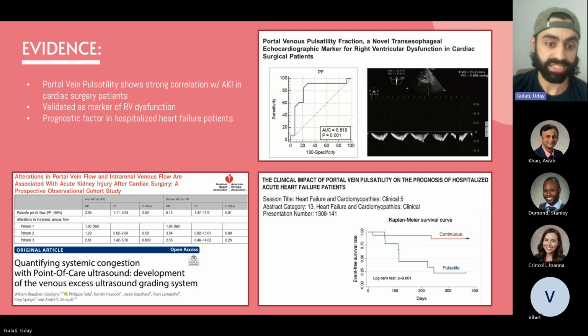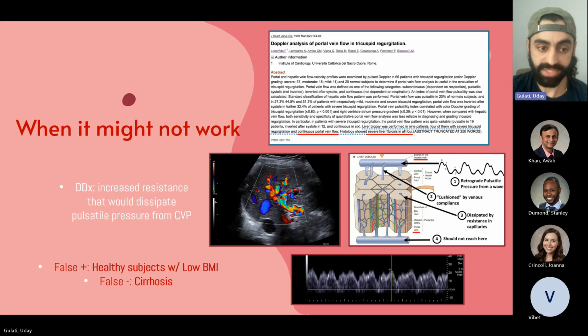Not everyone you classify as sepsis should be getting 30 cc's per kg, because when they come up to us and we put a probe on them, we see very commonly, more often than not, evidence that these patients are suffering from venous congestion, that their perfusion, their ability to perfuse their liver, to perfuse their kidneys, is impaired because of the amount of fluids they got. And if you are concerned about that, then you can apply the study and confirm that.